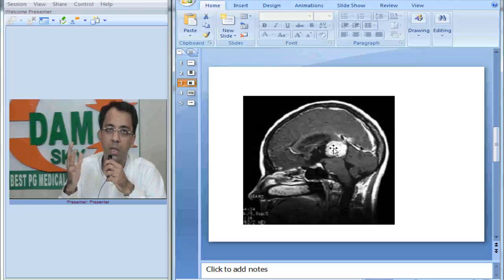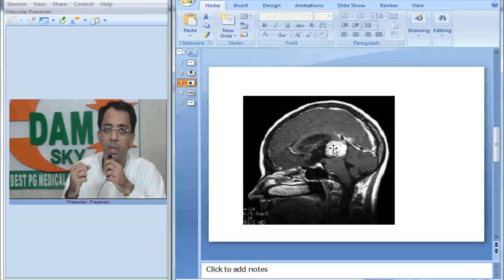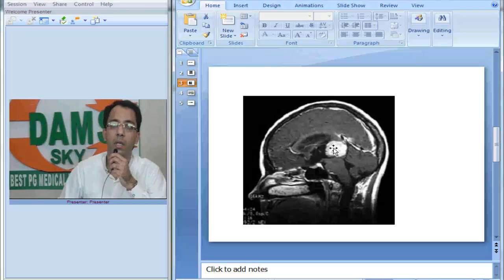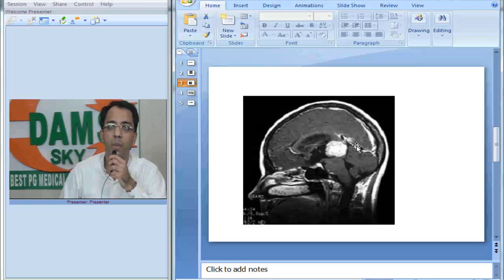But in the brain, if you see germ cell tumor, it is mostly located in the posterior part of the third ventricle in the region of pineal. So this is a pineal tumor.